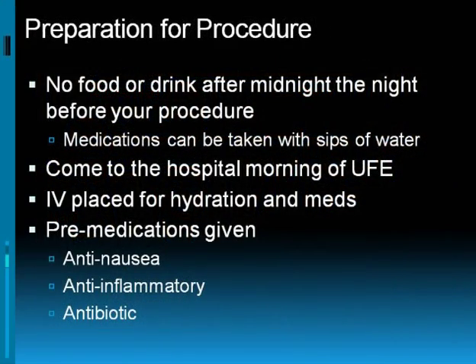Now, preparation for the procedure is listed here. The night before the procedure, you should not have anything to eat or drink after midnight, and this is primarily so that we can safely sedate you. Hospital policy indicates that we cannot give a person sedation if they've had any food within 6 hours, so you have to have a relatively empty stomach, and I say relatively because we do want to make sure that you take any medications that you normally take and just take them with a sip of water. What we don't want is the person showing up not having taken their high blood pressure medicines, for example, and have their blood pressure be through the roof.